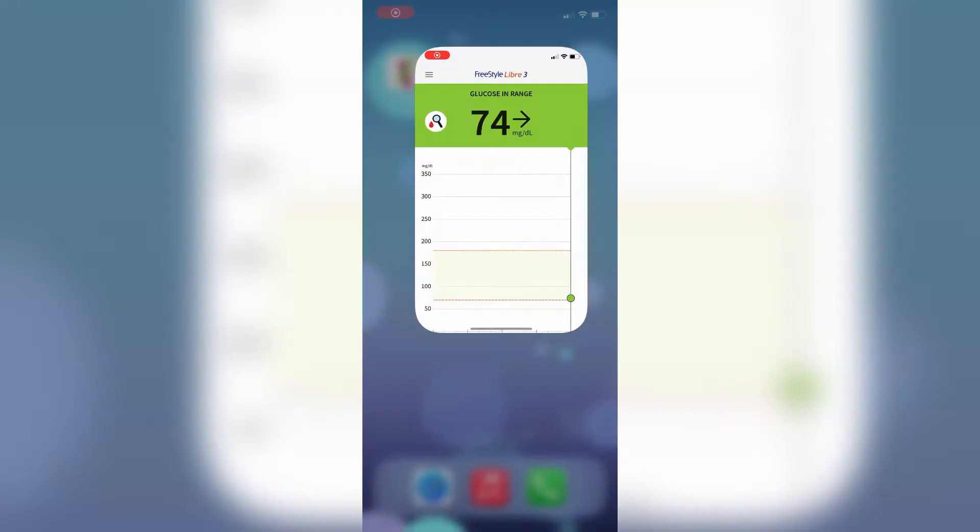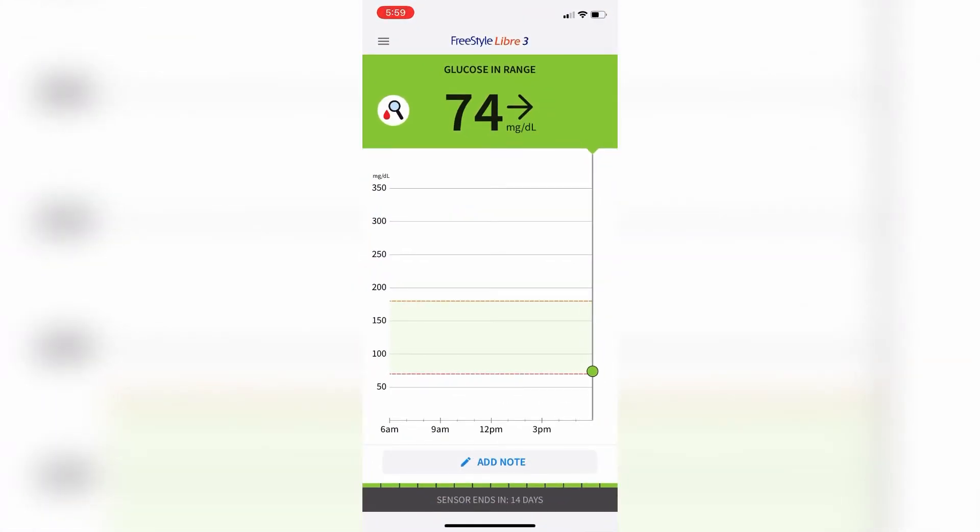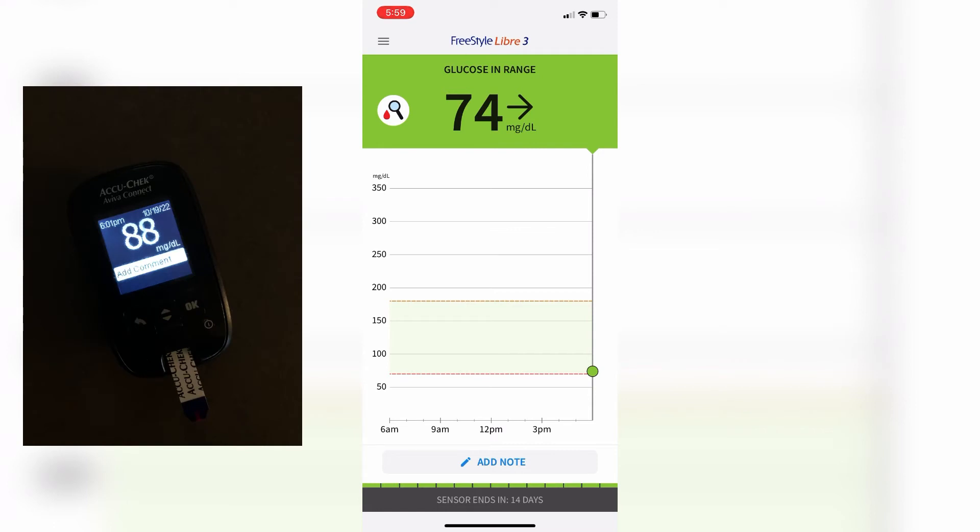Now the 60-minute warm-up period has started, which means no readings for 60 minutes. But once the warm-up period is over, you'll start to get readings in the app. My initial blood sugar was 74; I also did a finger stick and it said 88 — that's within what's considered accurate, so good enough and ready to go.